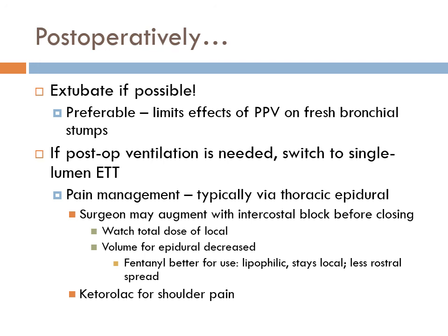If you're ever worried about edema, post-operative edema, but you think you can extubate the patient, stick this in. Tape it right to their cheek. Here's your airway.